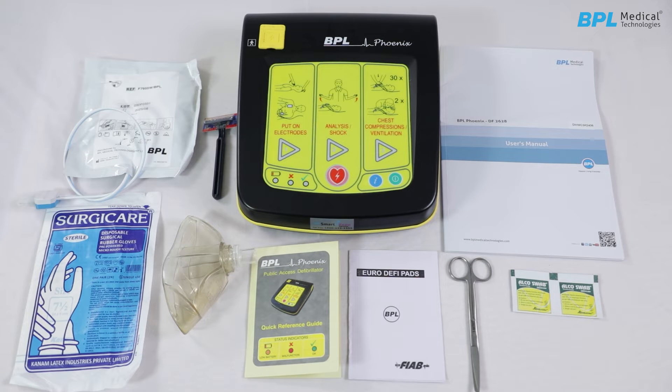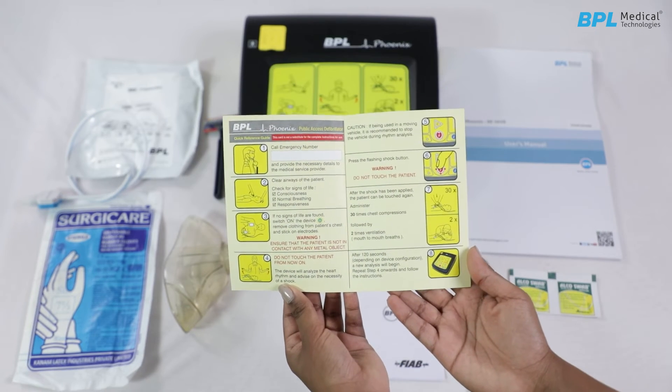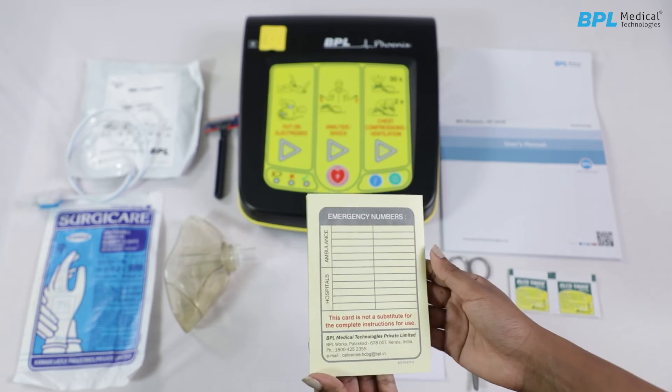Safety information. Do read the quick reference guide completely before operating the machine and use original accessories supplied by the manufacturer.